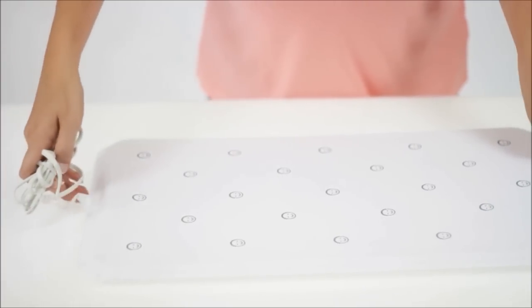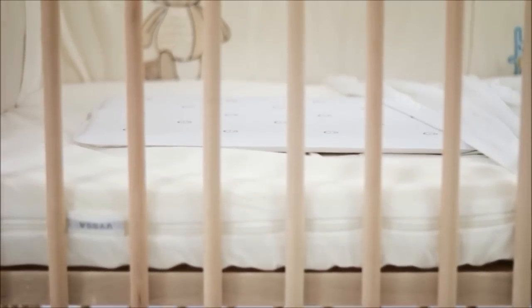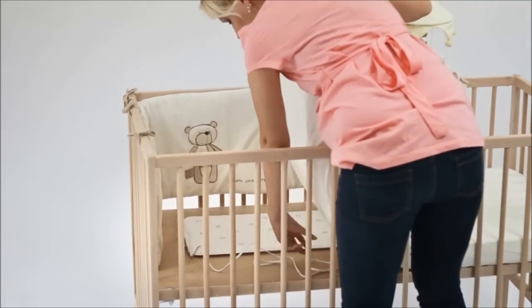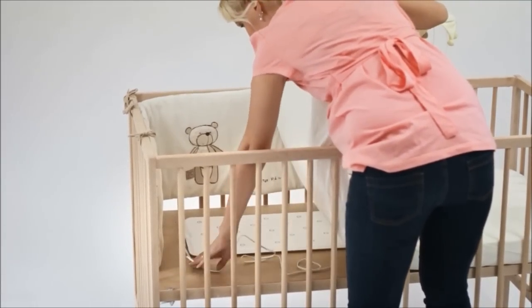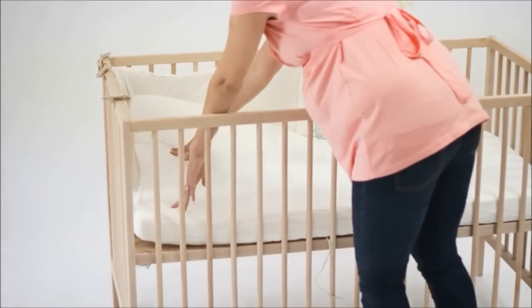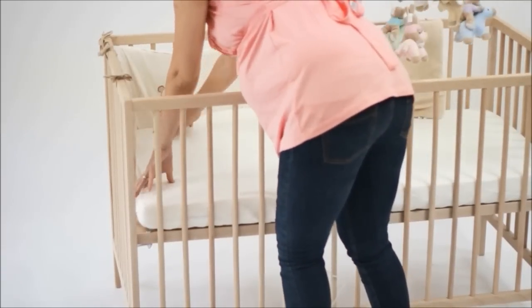The sensor pad needs to be placed on a flat and firm surface. If the baby is too small, it's better to place the pad directly under the sheets, and later when the baby starts to crawl and roll, you can place the pad under the mattress. The device has no direct contact with the baby's skin, so you can be sure that there can be no harmful effect on the baby.